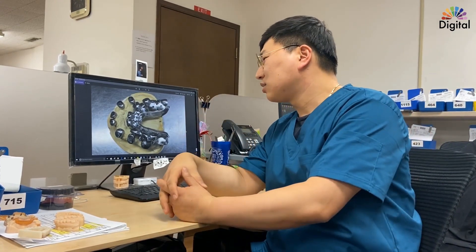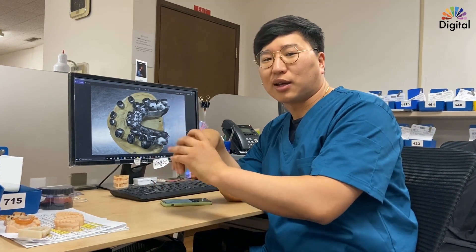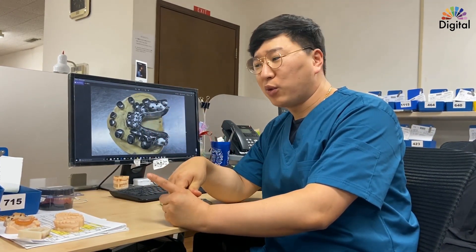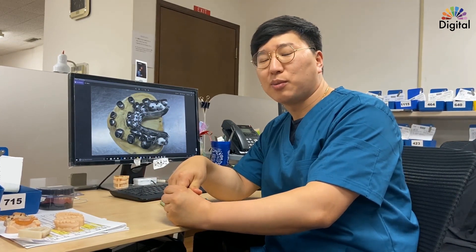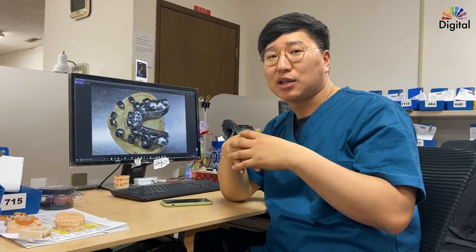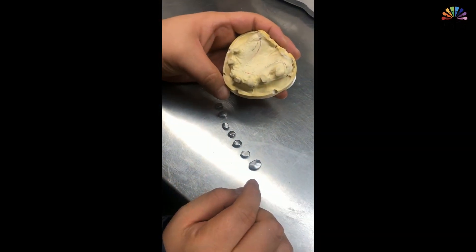Today I just want to share one of my cases with our doctors — a little special case with a titanium and cobalt chrome framework. As you can see in this photo, what we made was: first, telescope copings on top of the current teeth, then a secondary coping on top of the telescope coping, and then a final titanium frame for the full denture.